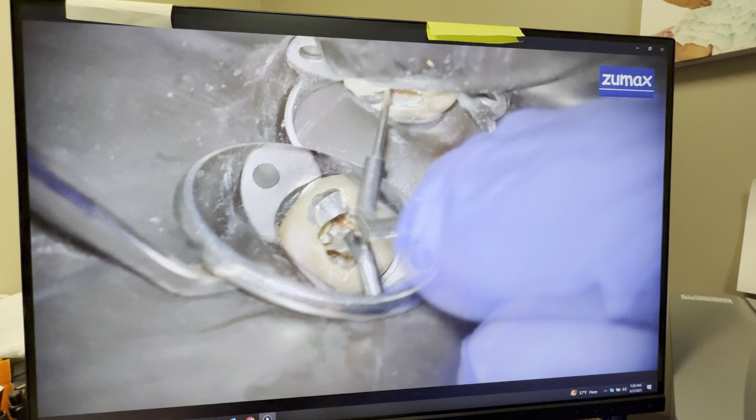And please, I'm begging you, don't do what I do as far as the obturation goes right now. Don't use the injection technique. If you don't know what you're doing, you're gonna inject so much gutta percha out the canals that sometimes you may have to do surgery. And worse, you could literally inject the thermoplasticized gutta percha in the lower teeth into the inferior alveolar nerve canal. So please don't do what I do. I've practiced on thousands of extracted teeth.